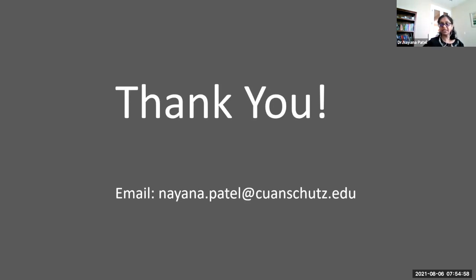So now we have more research coming out on the PI-RADS version 2.1 criteria and what the diagnostic performance of this new criteria is compared to version 2. So it keeps changing, keeps evolving. Once we have more clinical experience and more data, it will keep changing and evolving in the future too.